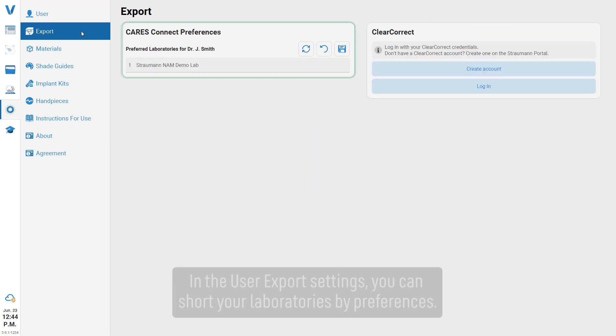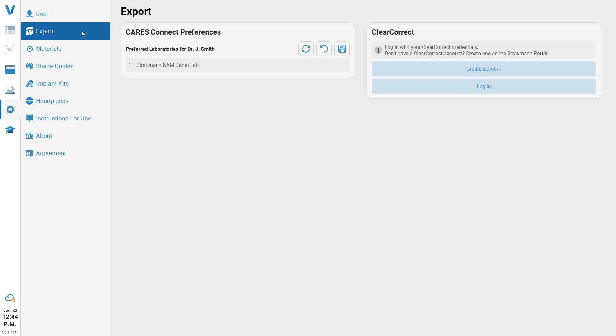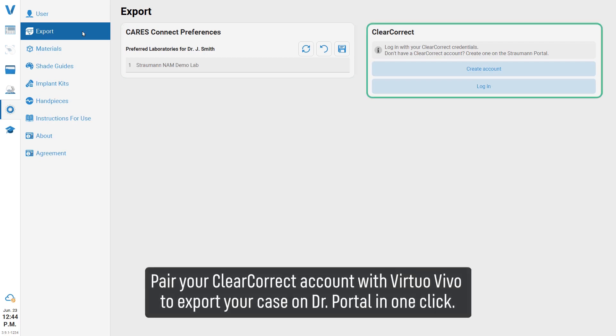In the user export settings, you can sort your laboratories by preferences. Pair your ClearCorrect account with Virtuo Vivo to export your case on Dr. Portal in one click.